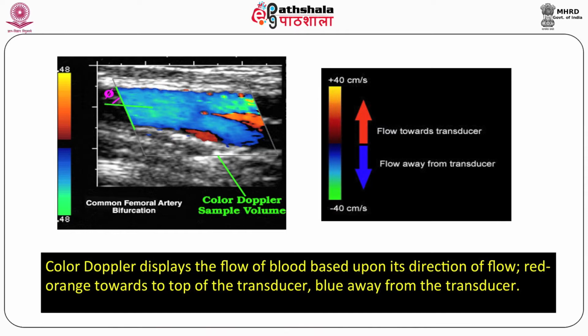The advantage of color flow Doppler is the technical efficiency, global Doppler sampling, flow throughout the entire lumen seen, localization of abnormalities better, improved definition of lumen, and rapid acquisition of data. But the disadvantage of color flow is that it computes the mean rather than the maximum velocity at each point.